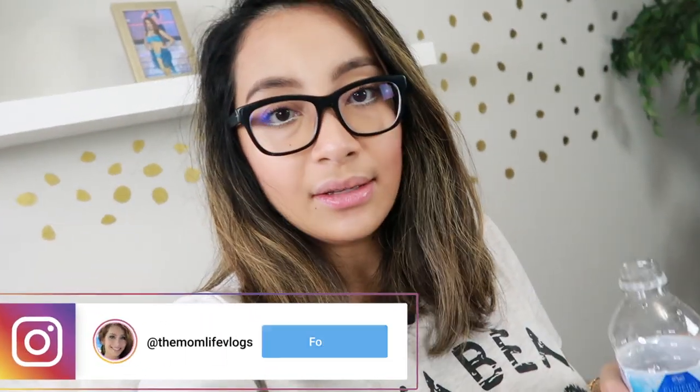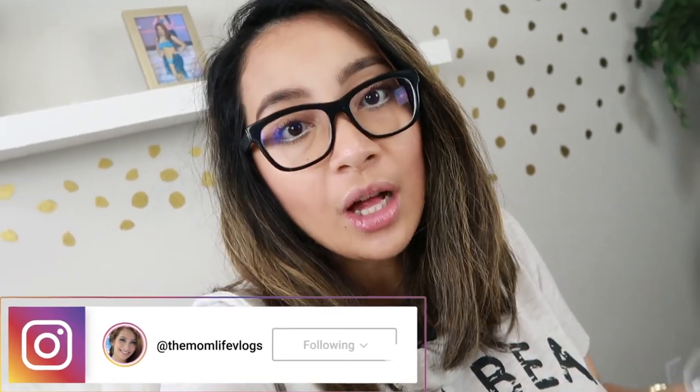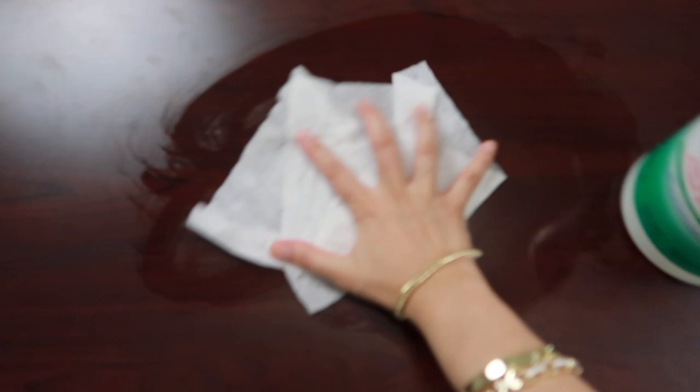First, you need to drink eight ounces of water before doing the test — it will help with the blood flow. So let's drink first and then we'll proceed. Next, you need to sanitize the area or table where you will be doing the test.